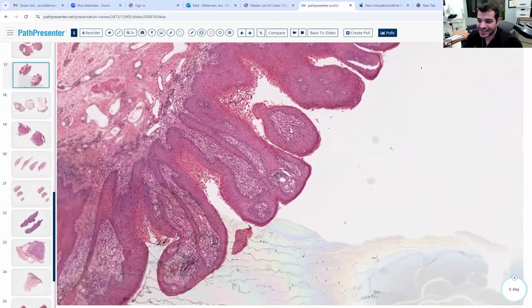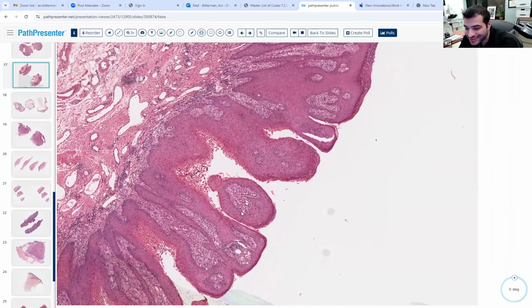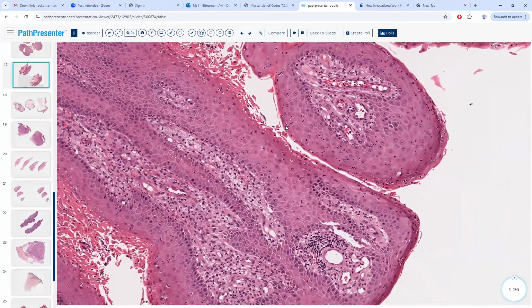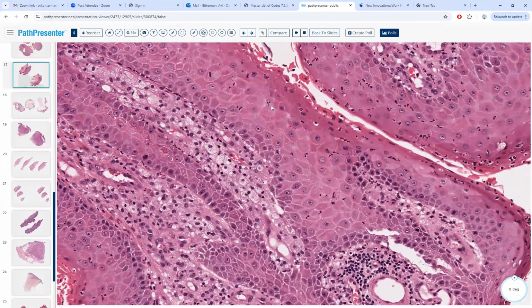And you can see there's this eosinophilic material here. Some describe this as a wart on fire. Verrucous papillomatosis? No, it is verrucous and it is papillomatosis, but that's not the name for the entity. Oh, I forget the name.